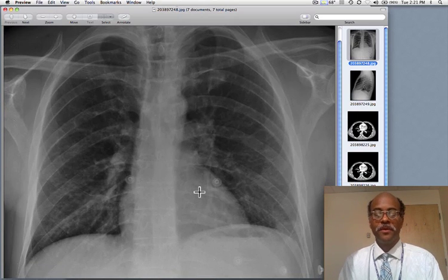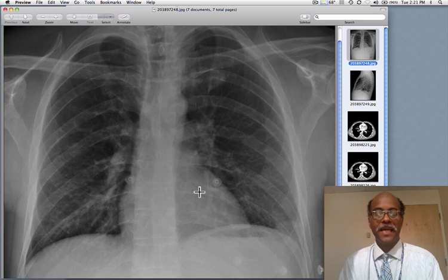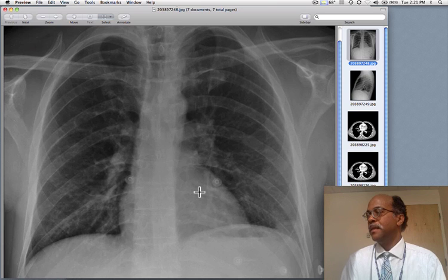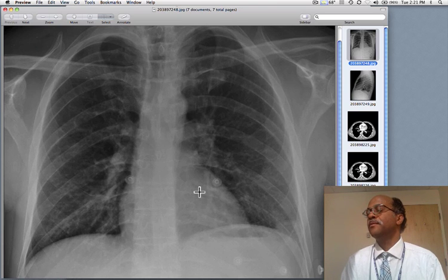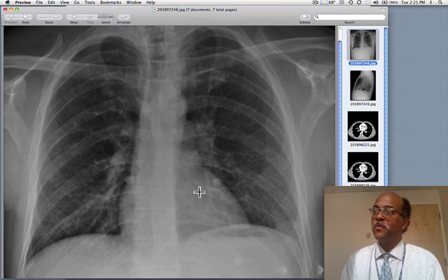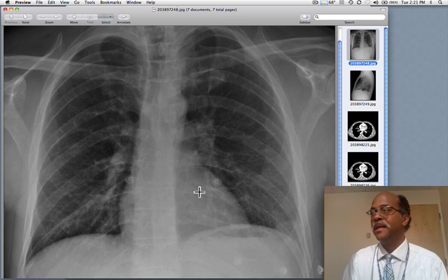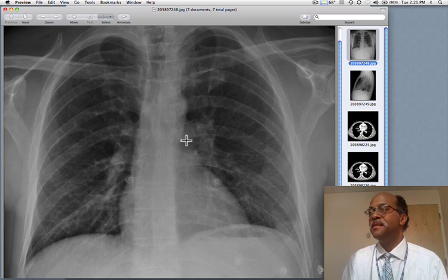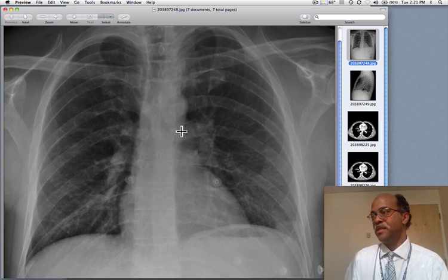Today I'm going to share with you three cases of pulmonary embolus and their manifestations. This is a patient that comes in with pleuritic chest pain. Can you tell which side it's on? Well, we had trouble with it — it isn't an easy case.